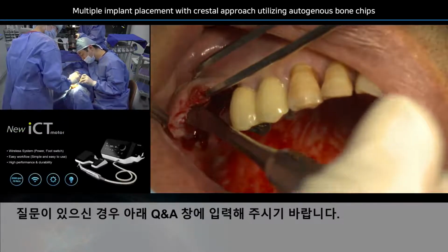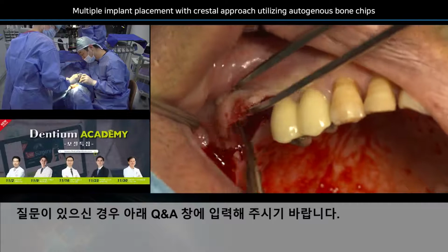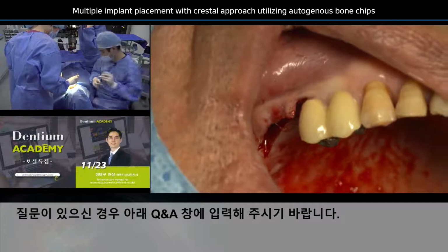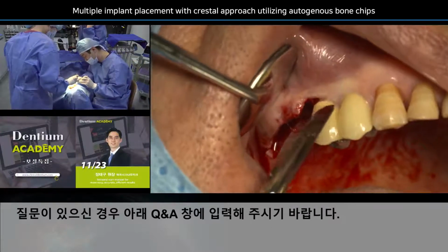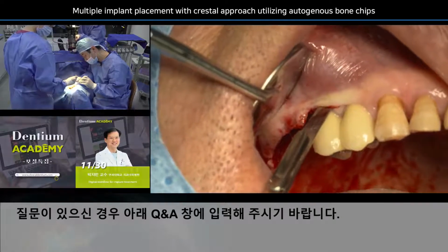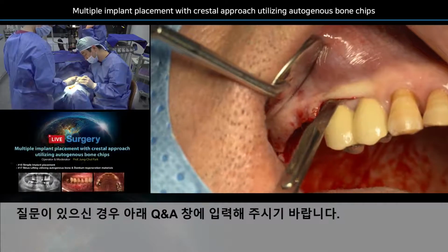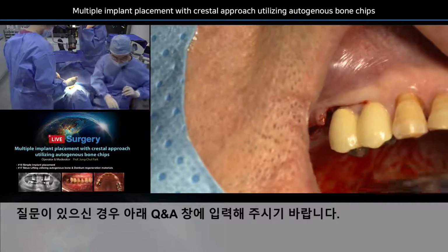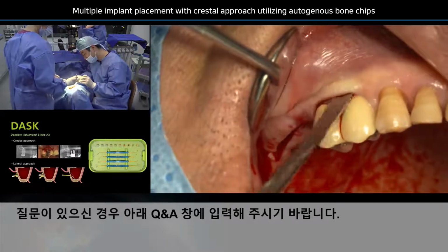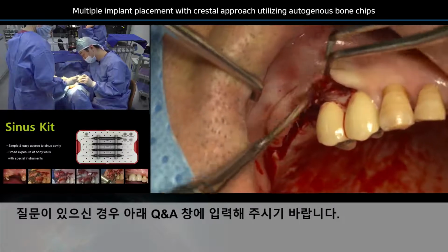Now we see the bone, and as you can see, the bony healing is not flat and it's a little bit difficult to see, right? So we are placing an additional incision. This is the papilla-based incision. And later on you will see that it is very easy to suture and it heals really well. So this is the papilla-based releasing incision. By placing a very small incision at the base of the flap, you can retract additional flap and you will have a better visualization of the bone here, like this.